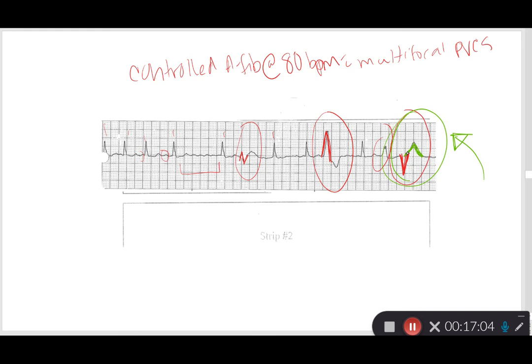Now, we will do a 12 lead if the patient is stable enough, because sometimes we can see that maybe it's a bizarre looking SVT or something else going on in the heart. We just want to confirm that it's VTAC. But this is not ST elevation, so you do not need to label ST elevation on ventricular rhythms.